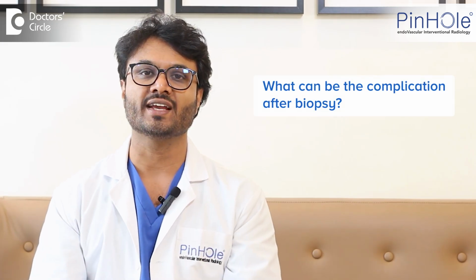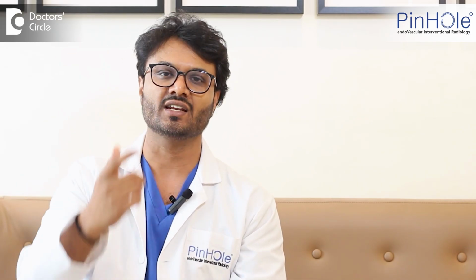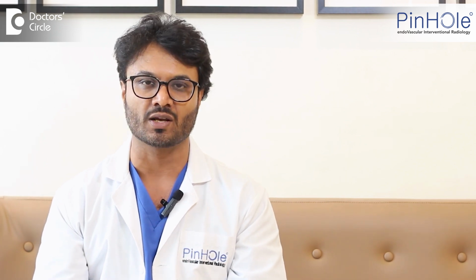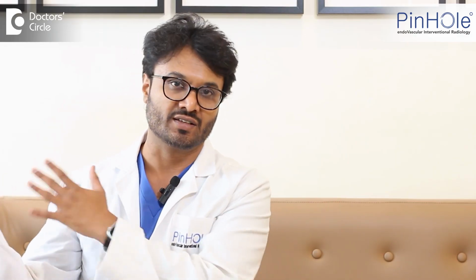So, what complications can we have after we do these biopsies? Like anything, we get hit somewhere, we may get injury or bleed. So now when I stick a needle into your body, there is a chance that you may have a bleed. And these bleeds are usually not torrential because we are doing it under image guidance and we are avoiding all major structures or blood vessels which are coming on our way. So even if there's a bleeding, we always categorize all the complications as mild, moderate, severe.